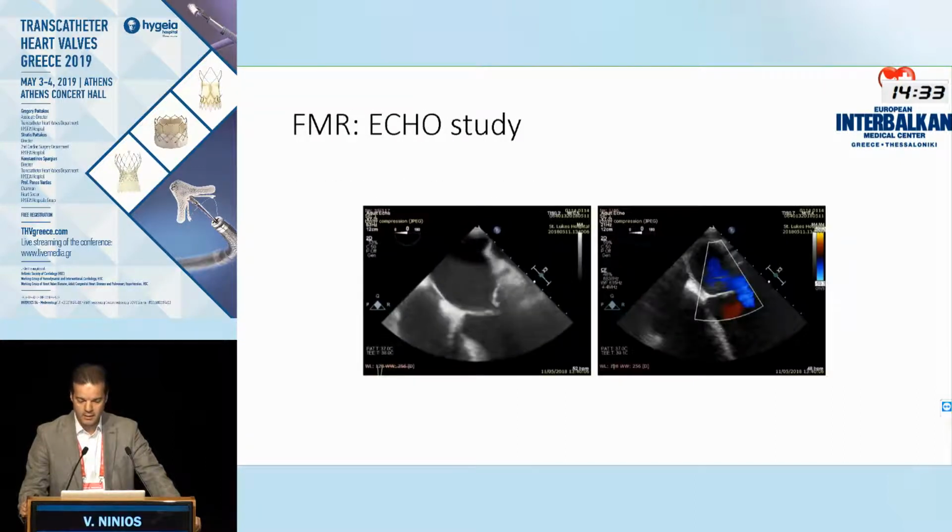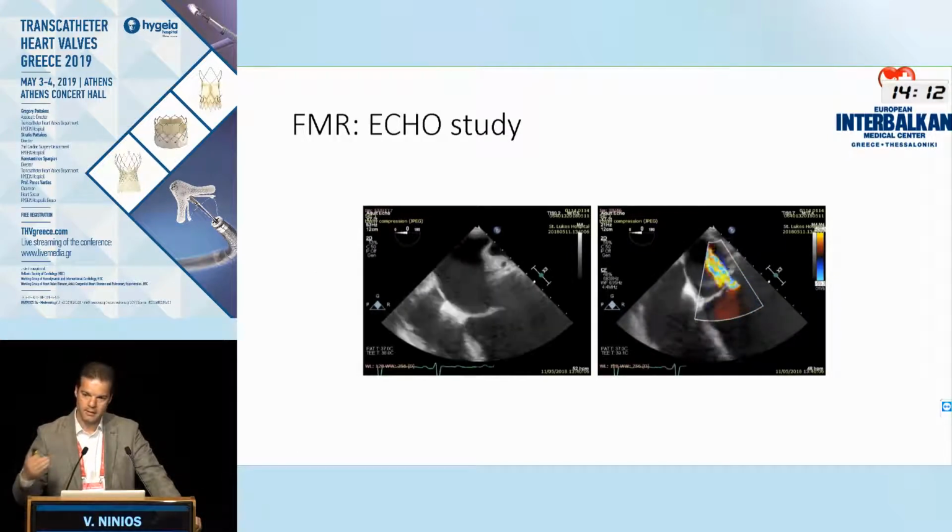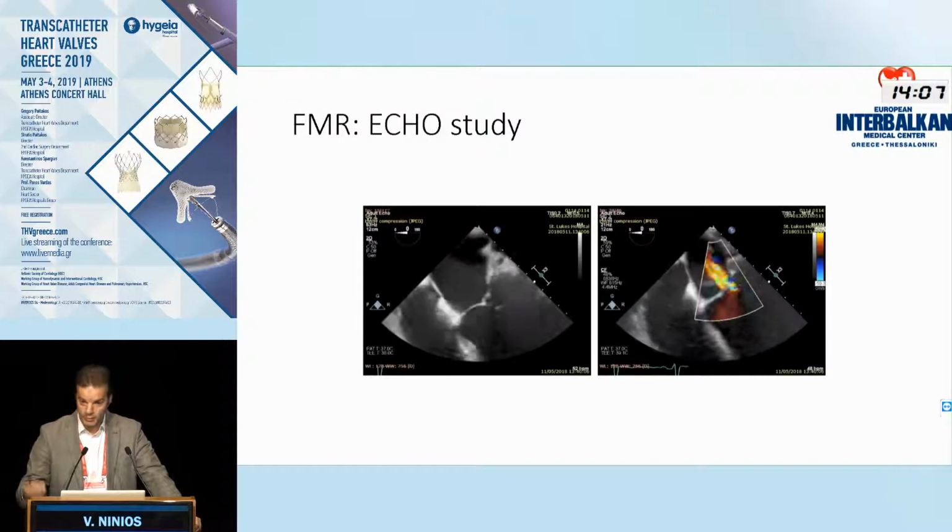I have to say that when we started the MitraClip journey about 5-6 years ago, or even more, we were told by our trainers that we should be aiming for a 50% reduction of the mitral regurgitation at 2+ MR or below. And that actually was what we intended in the first initial 10-20 cases. But as the technique evolved and the clips became better, and our understanding of the predictors of mid and long-term success were made clear by the registries and the trials, we started to aim for a 0 MR.